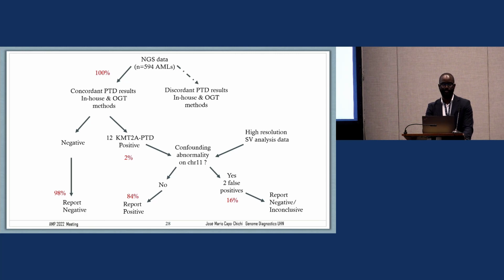At the moment, we haven't identified any discordant calls between our two NGS calling algorithms. But if we were to identify such a discordant call, we will also resort to high resolution structural variant analysis to resolve them.